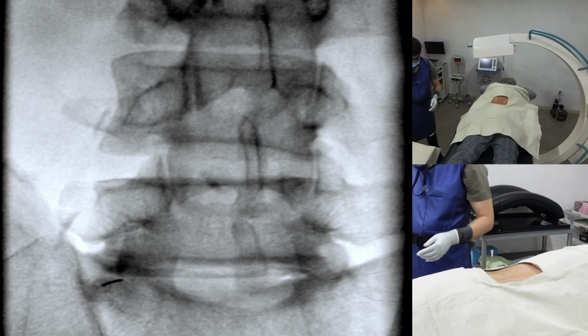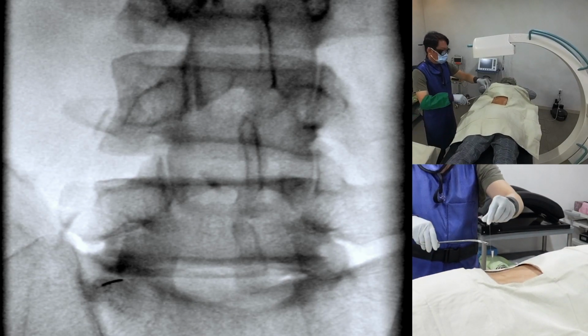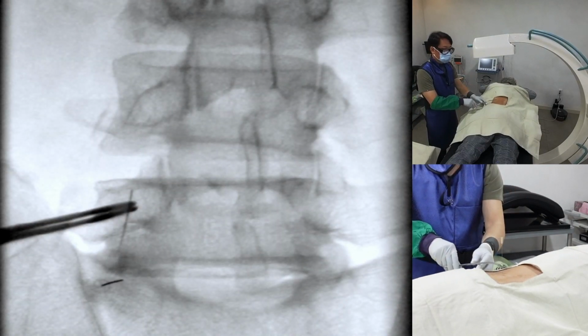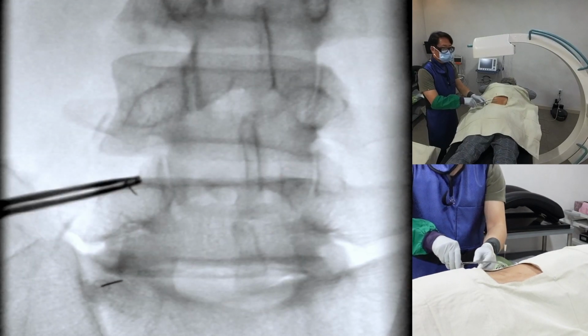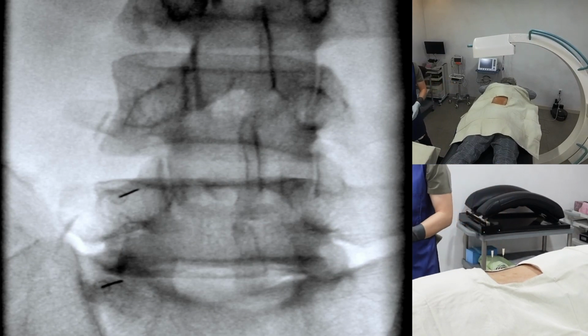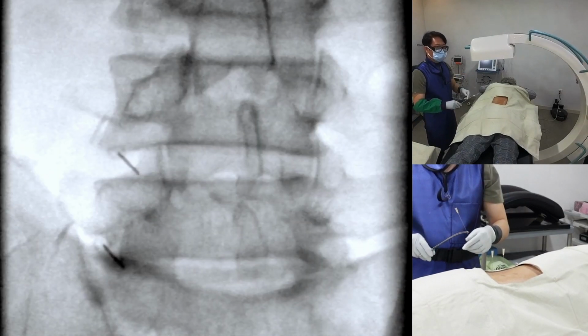So try to find the cortical margin of the transverse process and the lateral aspect of the articular process. Needle insertion: under C-arm guidance, insert a 26-gauge, 9 cm long needle without a stylet. I do not anesthetize the skin because it wastes time without benefits. Adjust the C-arm as needed to visualize the target medial branch locations in the oblique view.